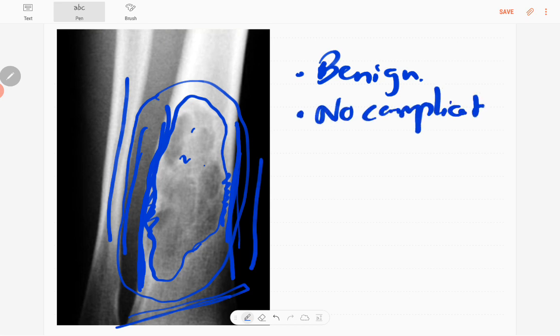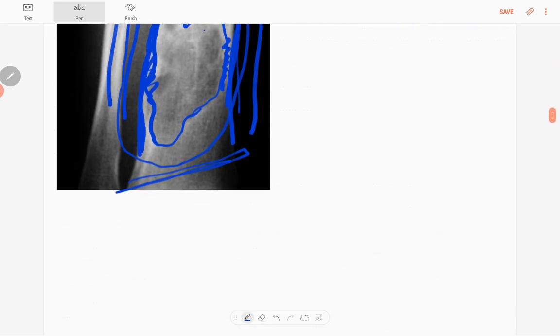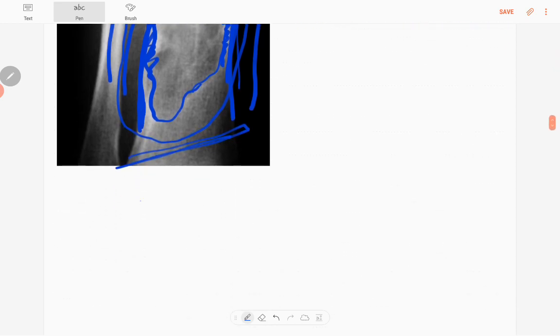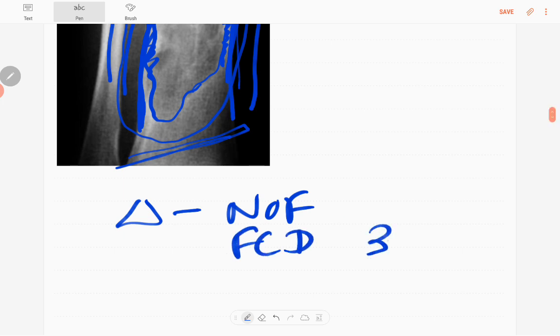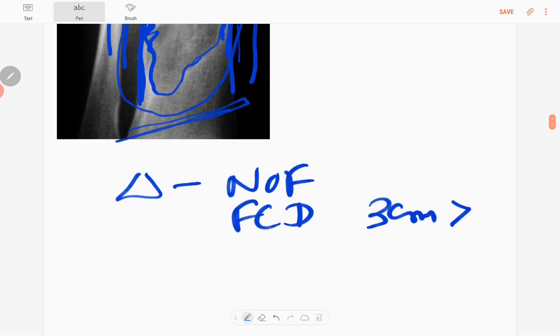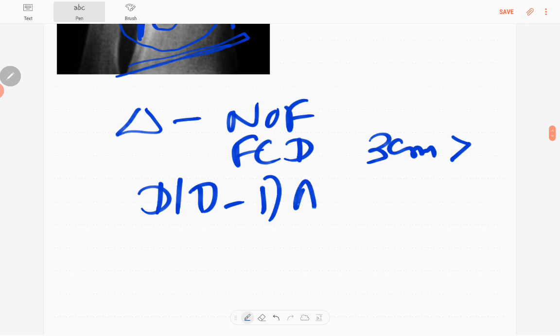The diagnosis of this lesion is non-ossifying fibroma. You call it fibrous cortical defect if it is less than three centimeters. The differential diagnoses are aneurysmal bone cyst and chondromyxoid fibroma.